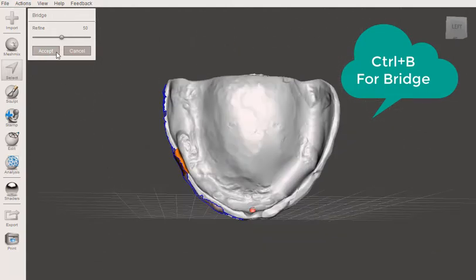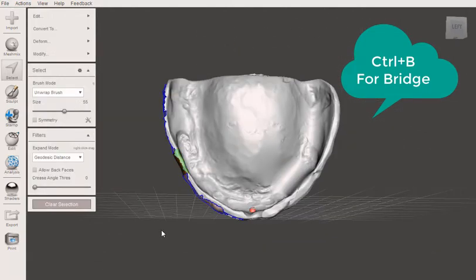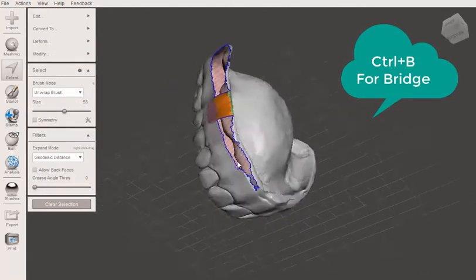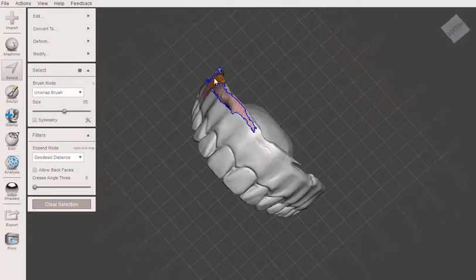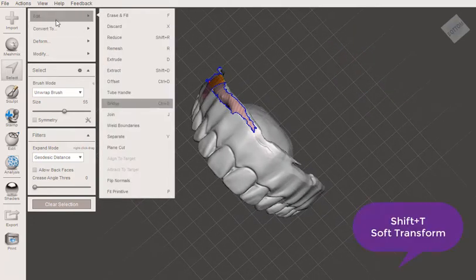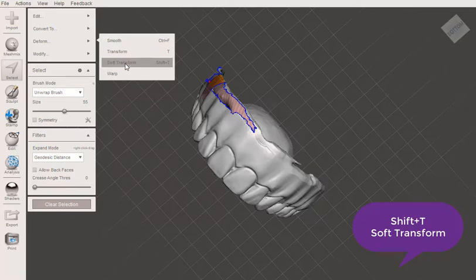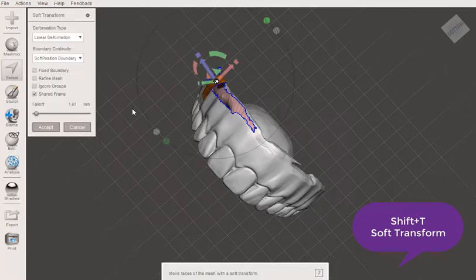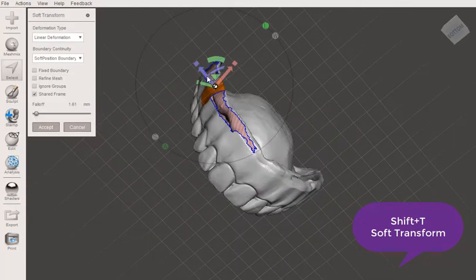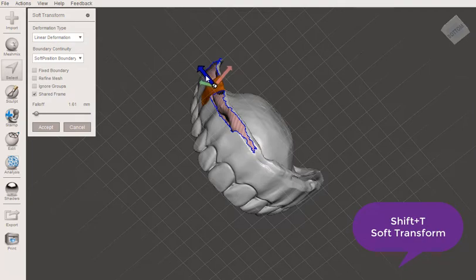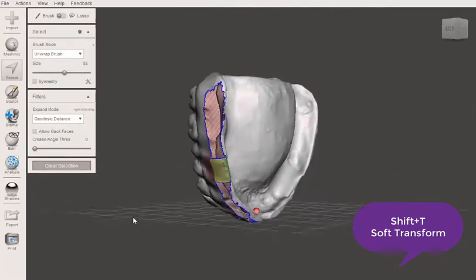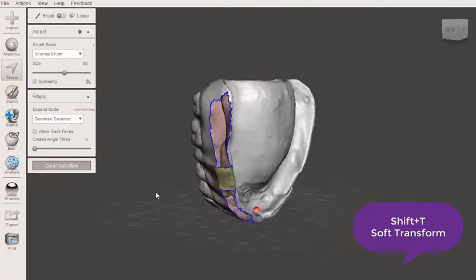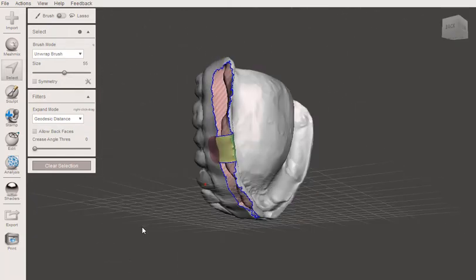Now, if you need to, another cool little thing is if you needed to move this in and out, you can go to deform, and you can hit soft transform. And you can move this in or out, or move it however you need to. I didn't really need to there, but I just wanted to demonstrate it in case if you do need it.